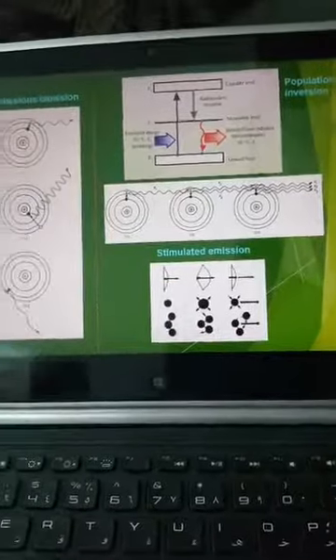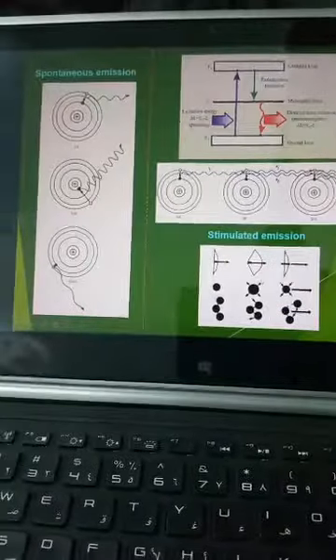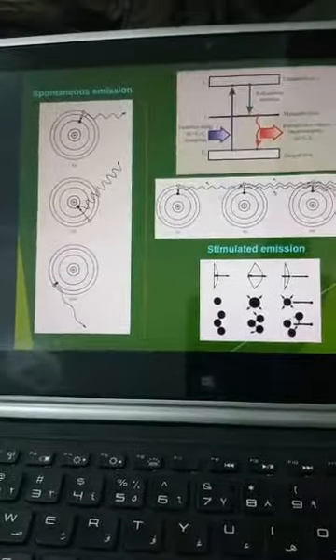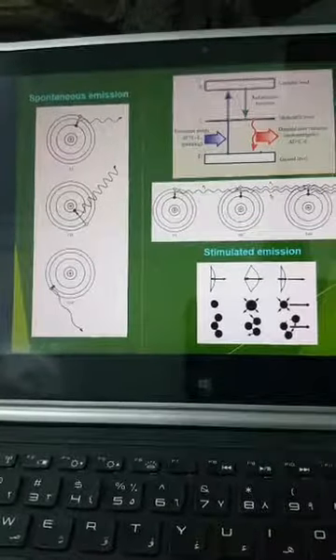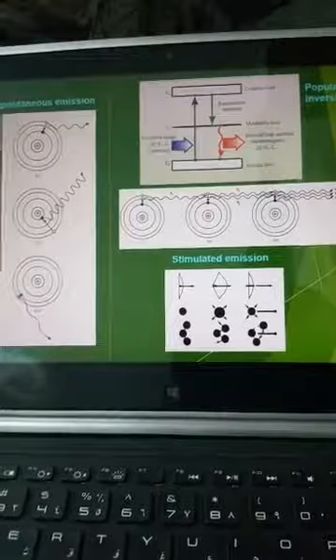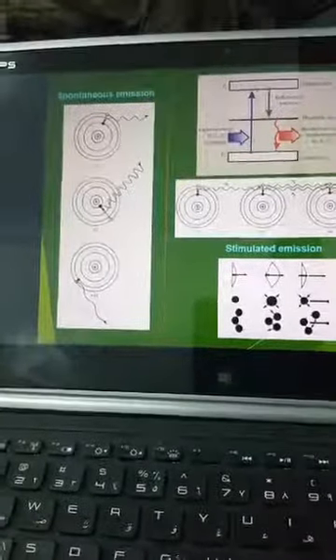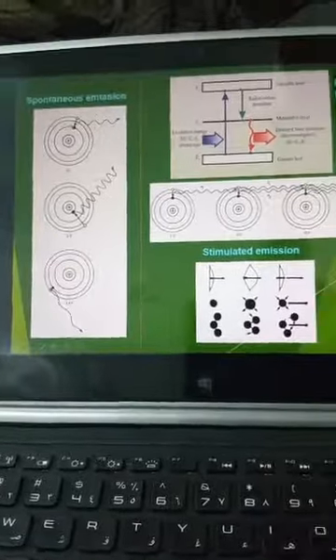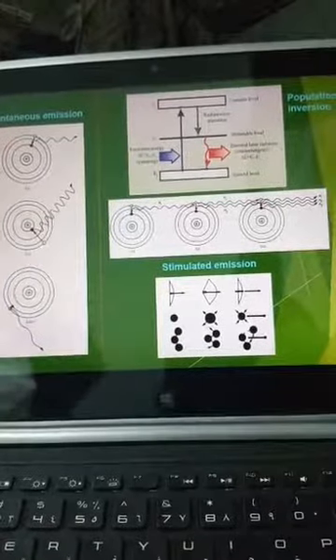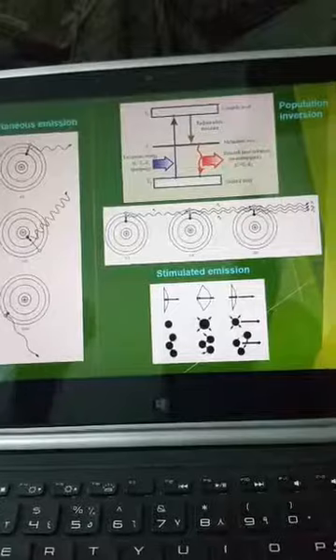And I think we have studied in dentistry, like if you could see here, I mean the arrow, if you pull it very hard, this gives more energy, and here two wavelengths together, the peak with the peak, we studied in the physics, this gives a higher peak, so it gives its reinforcement. So that gives the laser more power. So the more wavelengths coming together in a harmony way, this gives more energy in the light. So the difference between normal light and the laser light is intensity. It is more intensified, so it has more energy than normal light.